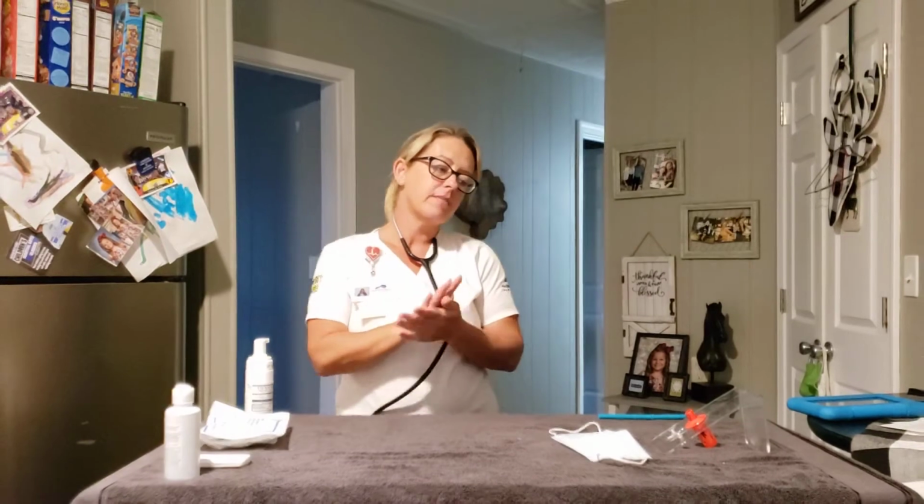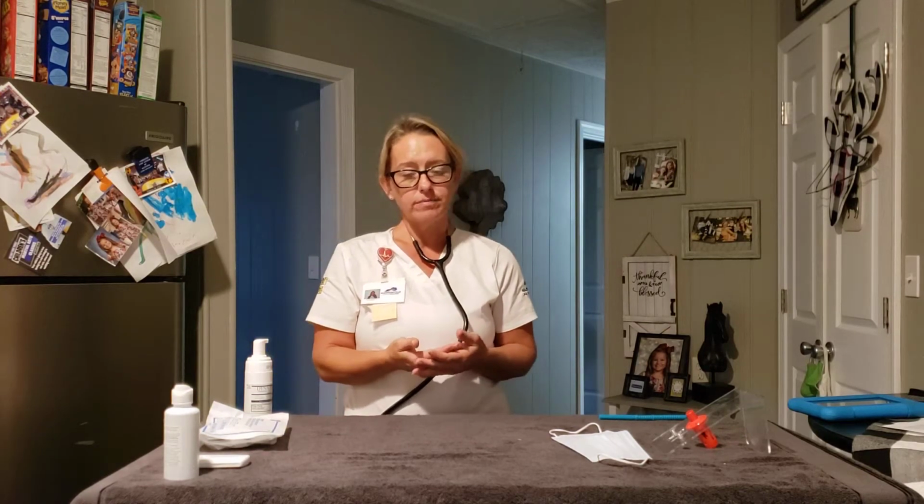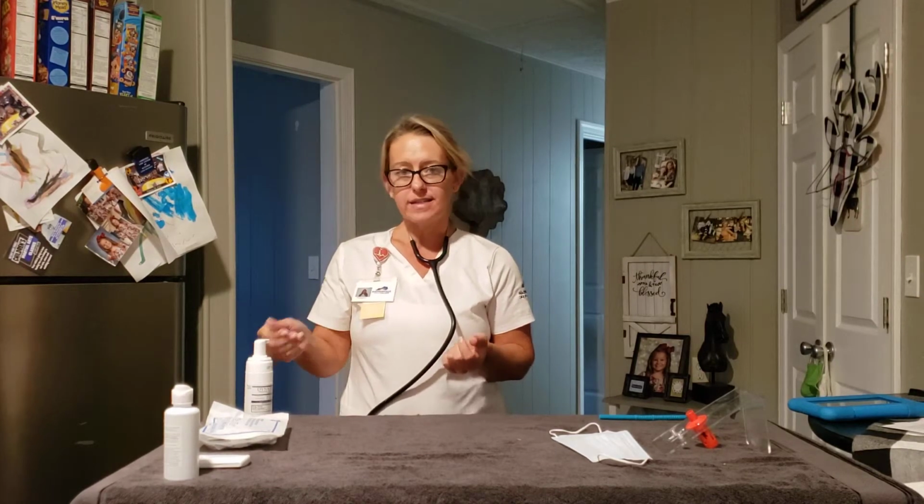Okay, upon looking at Miss Fitzgerald, I can tell that she is having problems with breathing, and she has yellow, scant, thick secretions coming from her trach. So we're going to go ahead and initiate the trach suctioning. But first, I'm going to go ahead and let her know that we're going to be doing an assessment.